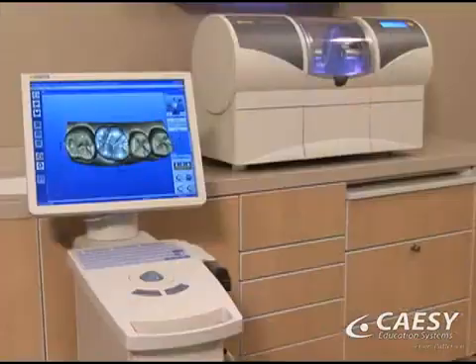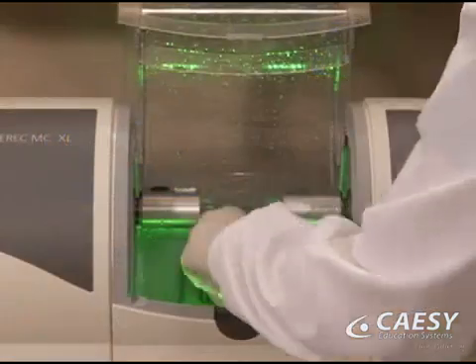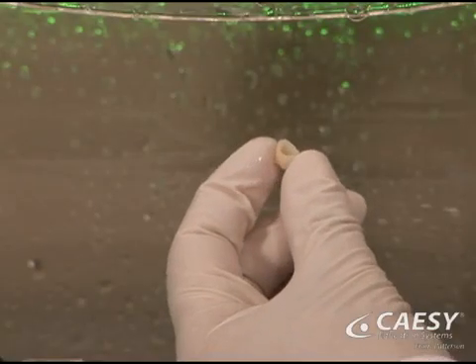When your teeth need restoration, we can use CAD-CAM technology to create natural-looking inlays, onlays, crowns, or veneers in just one appointment.